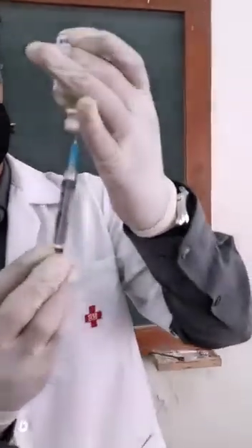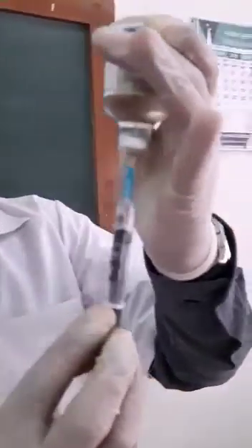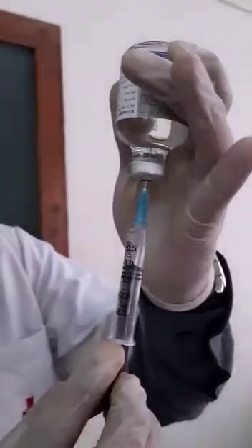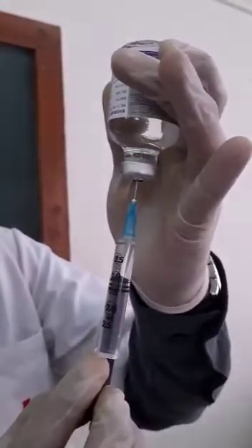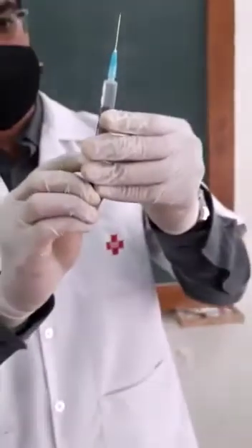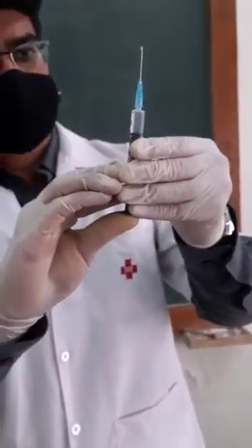Aspirate the required amount of the solution and 0.1 ml extra. Make sure the tip of the needle is below the fluid surface. Pull the needle out and remove any possible air from the syringe. Clean up and dispose of the waste safely.